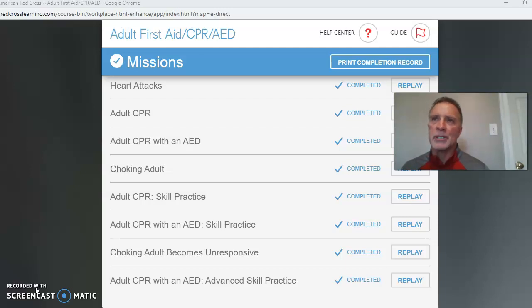Remember, this person is unresponsive. So what you would do is you would position yourself to be able to give 30 compressions, which accounts for 100 to 120 compressions per minute. Then you would give two rescue breaths, and you would continue that cycle until assistance comes or the EMTs arrive. Okay? Then the D, that person you sent back on the S, they went and got the defibrillator, the AED.